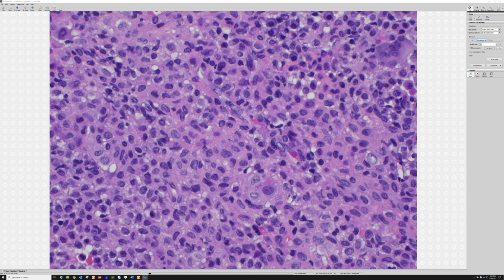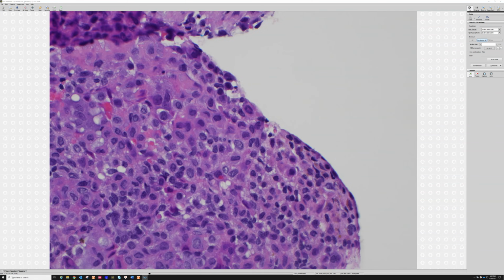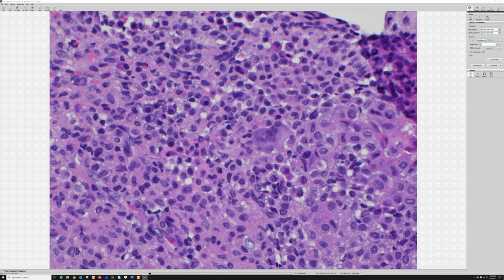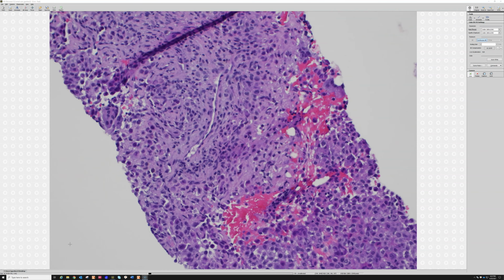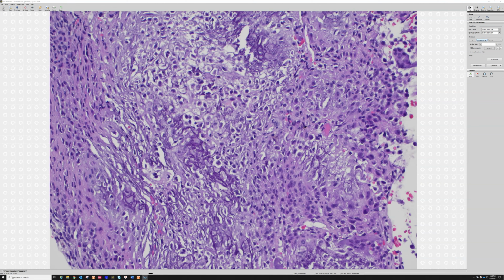So these kind of grooves and bean-shaped, coffee bean-shaped, some people like to say, cells, that of course is the buzzword for the tumor that we're looking at here, which if you're at home, you're hopefully shouting out the answer right now. And then also some scattered giant cells, commonly seen in this tumor and in many other bone tumors for that matter. But the thing you're all waiting to see is this, right? The ultimate buzzword, the chicken wire calcifications.